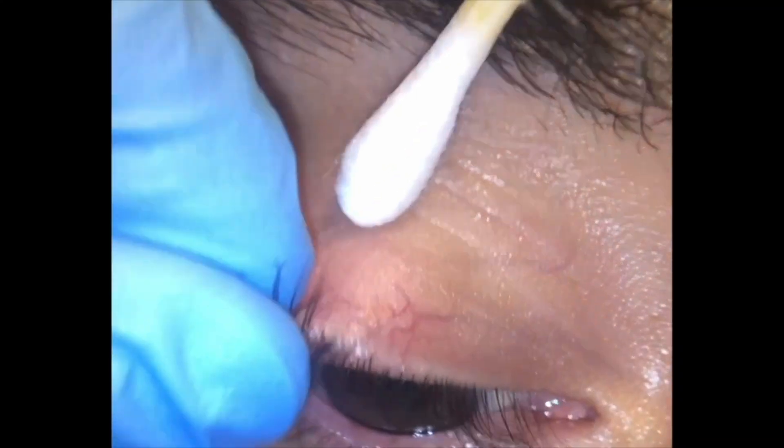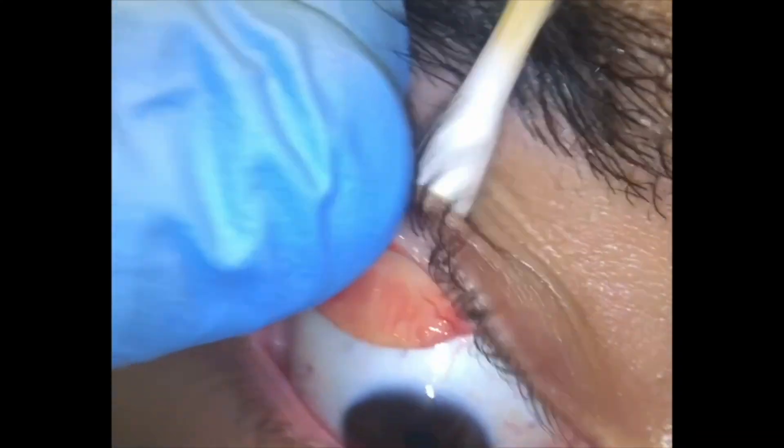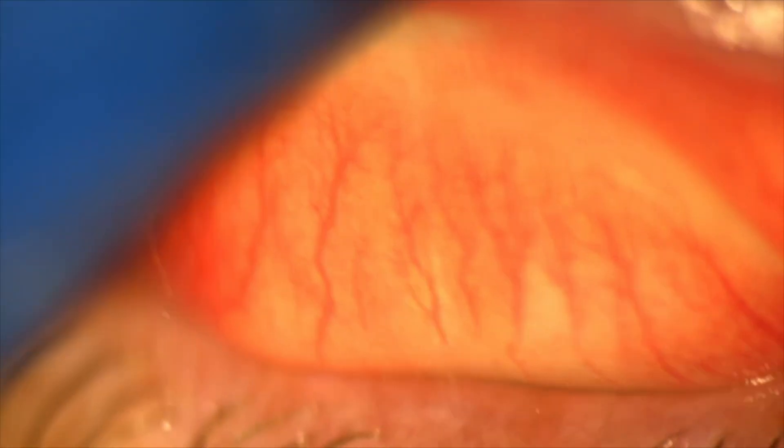Also examine the conjunctiva, sclera, lower fornix, and upper tarsal plate by everting the lid. If a foreign body can be seen and no other serious signs are present, proceed with removal.